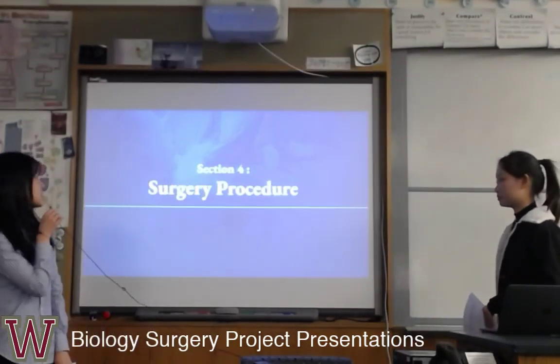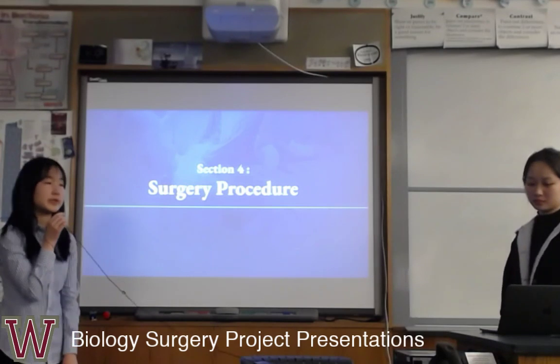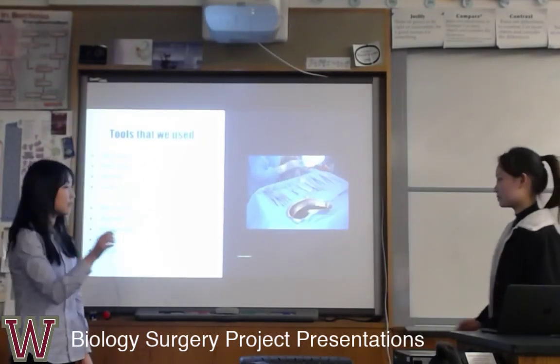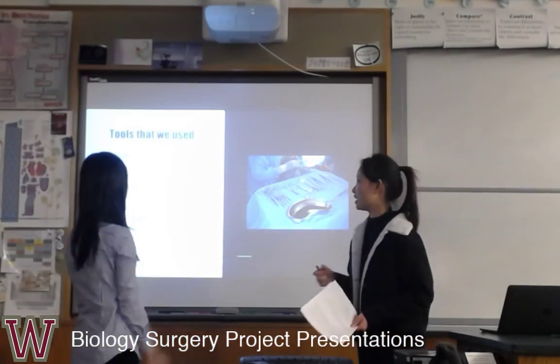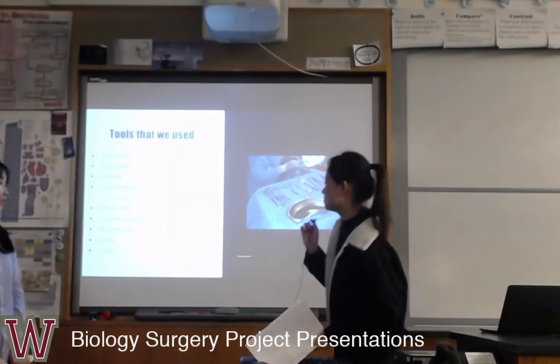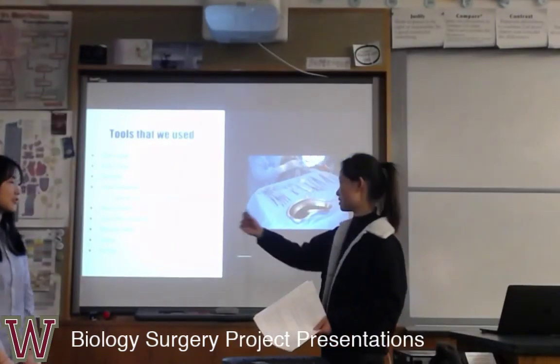So we enter section 4, which is the surgery procedure. Here are some tools that we use. Basically some clamps, scissors, staples, and stitches.